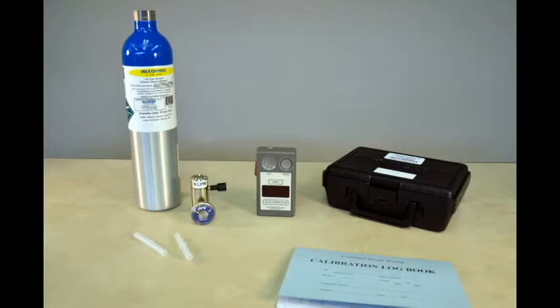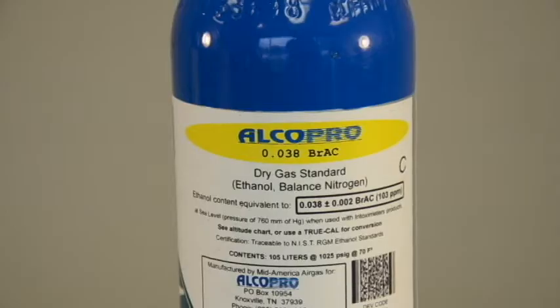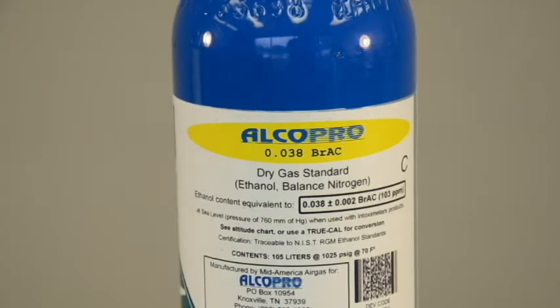To perform an accuracy check, you will need the following materials: your Alkosensor 3 device and a new mouthpiece. You will need an alcohol gas standard. We will be using a dry gas standard with an ethanol content of .038 BRAC at sea level. The dry gas standard concentration can be located on the gas tank label.